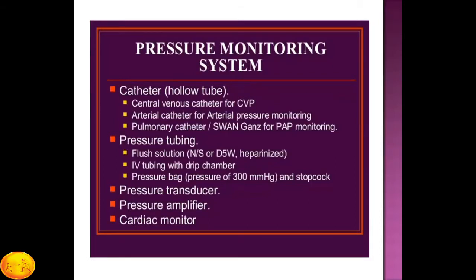Now these three are the integral part of hemodynamic monitoring, and these three are also called invasive hemodynamic monitoring. Recently we have many non-invasive hemodynamic monitors, but it is not today's topic of discussion. Today we are basically discussing invasive hemodynamic monitoring. Just remember, in invasive hemodynamic monitoring, we have to assess the central venous pressure, arterial blood pressure, and the pulmonary artery pressure.